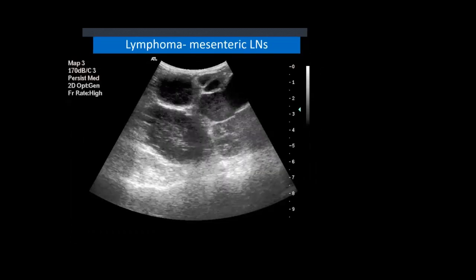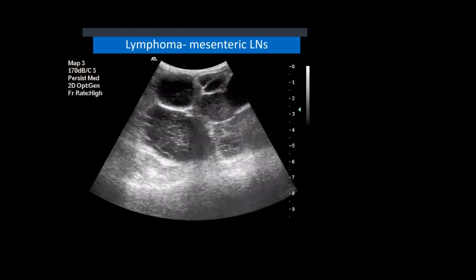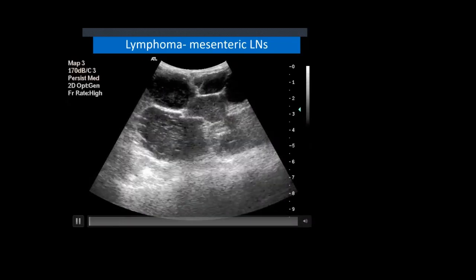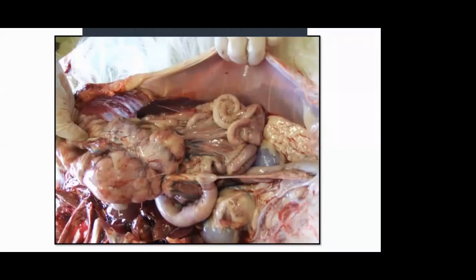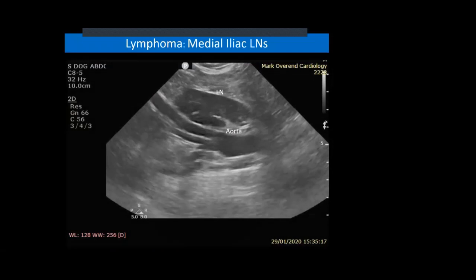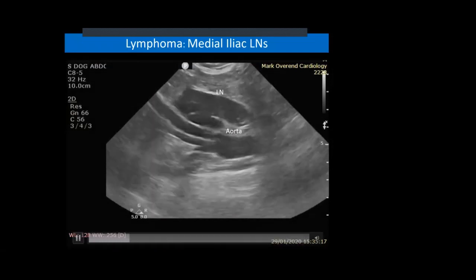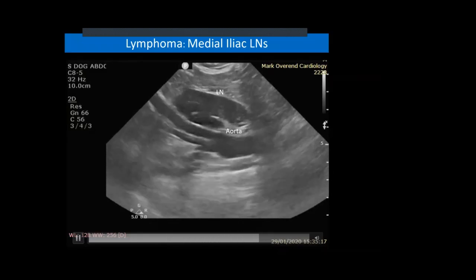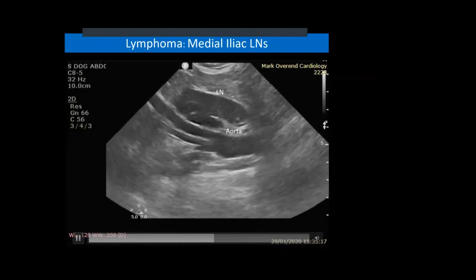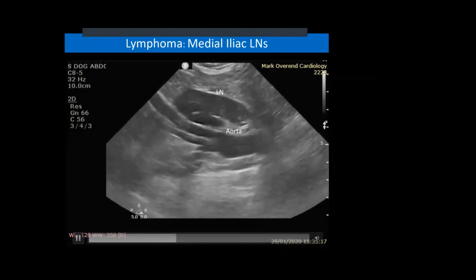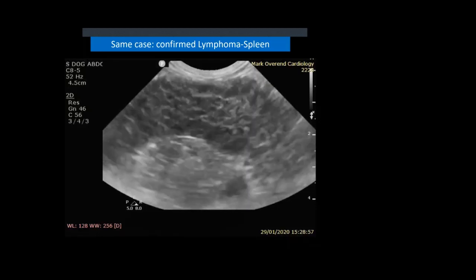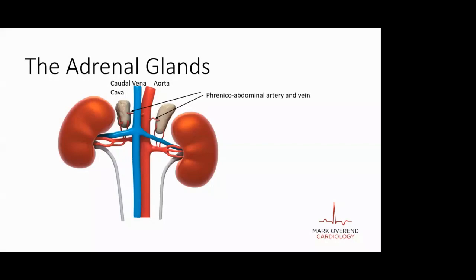This is the same view in short axis: the aorta in the middle and these golf ball-like neoplastic medial iliac lymph nodes. Then here are mesenteric lymph nodes - plural - and these lymph nodes are massive. There's a five centimeter marker on the right-hand side of the screen. This is typical of what you see with lymphoma; this was actually the postmortem of this case. Here's another lymphoma: a medial iliac lymph node that's enlarged, hypoechoic and heterogeneous at the aortic trifurcation. Confirmed lymphoma by FNA.